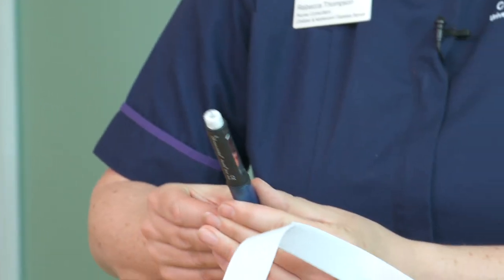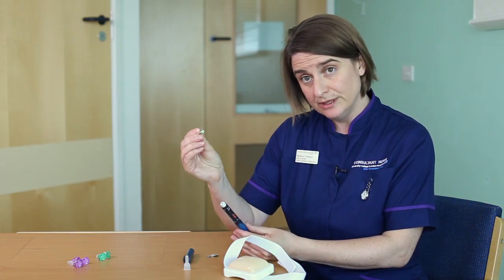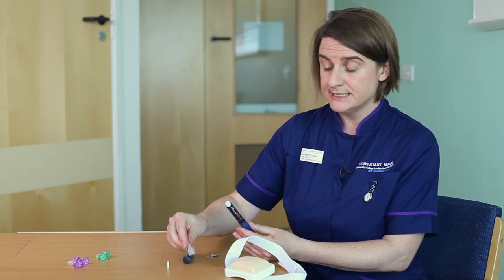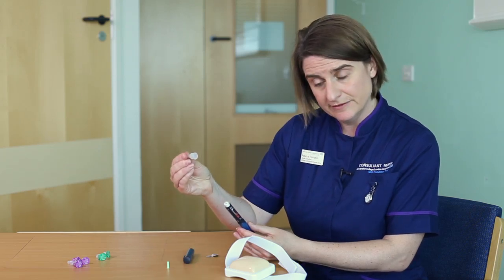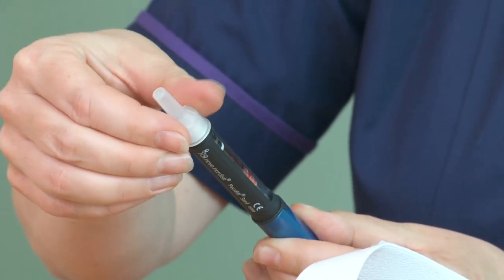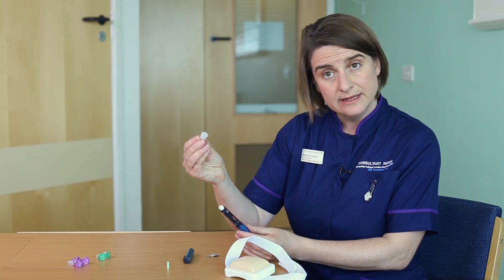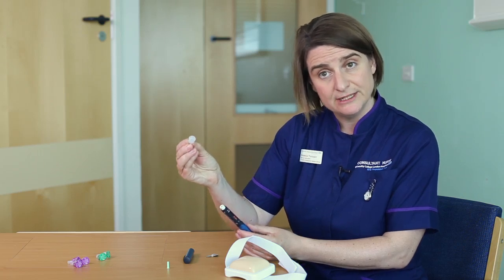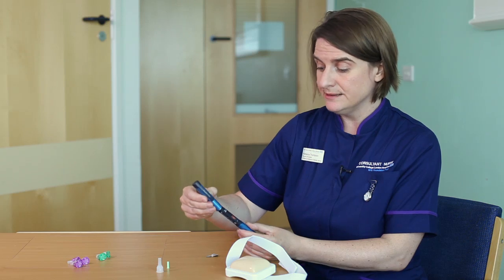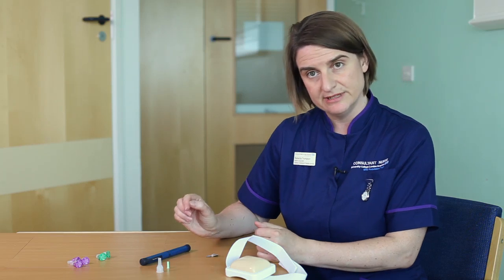To remove the needle from the pen, do not put the small needle cover back on because of the risk that you'll cause injury to yourself. Instead, use the plastic cover and carefully place it back on the pen and twist off, and then the needle can be disposed of in your sharps box. Put your pen lid back on and you've done your insulin injection.